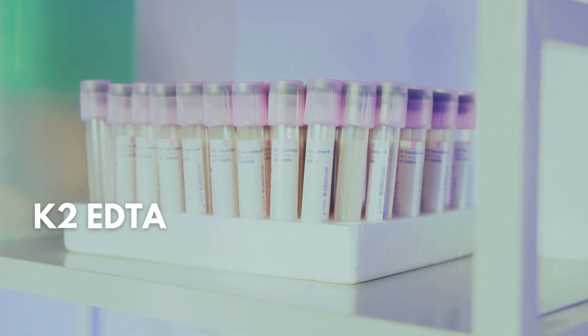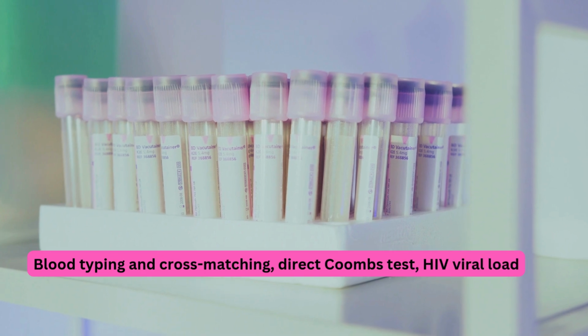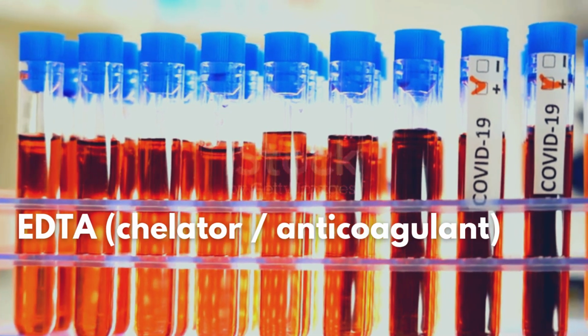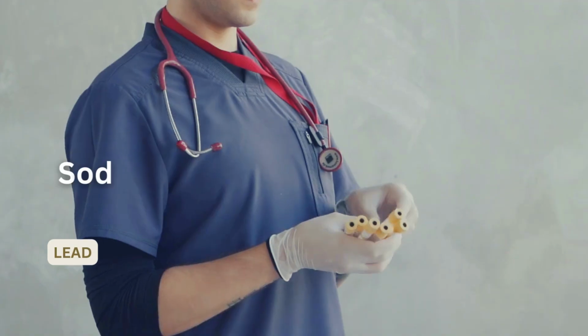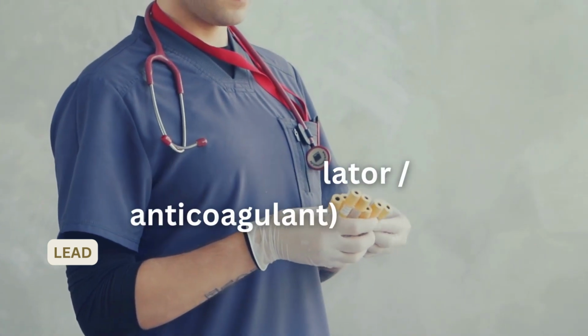Pink K2 EDTA additive is used for blood typing and cross-matching, direct Coombs test, HIV viral load. EDTA, chelator anticoagulant additive is used for trace elements, heavy metals, most drug levels, toxicology. Tan color lid test tube contains additive of sodium EDTA for lead.